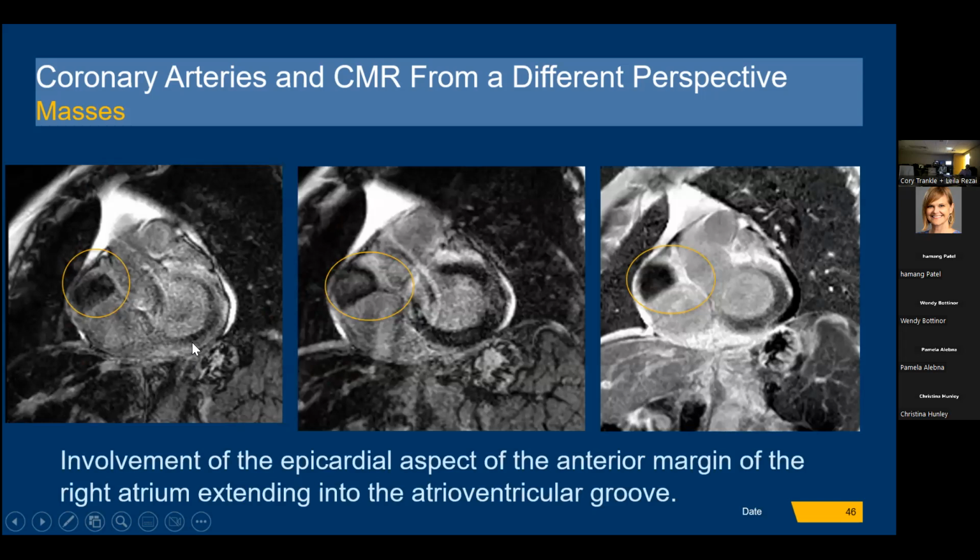The patient had very significant arrhythmia. However, the best attempt was made to obtain some images. These are the post-contrast, post-gadolinium sequences. We see the mass. It's not really enhancing, or it's mildly enhancing heterogeneously. It's in the same location we talked about. And then we have the coronary artery present here.